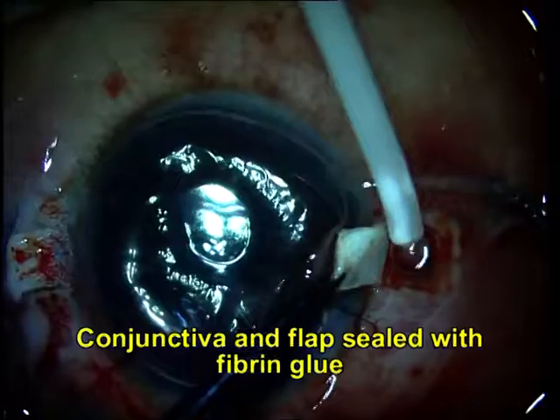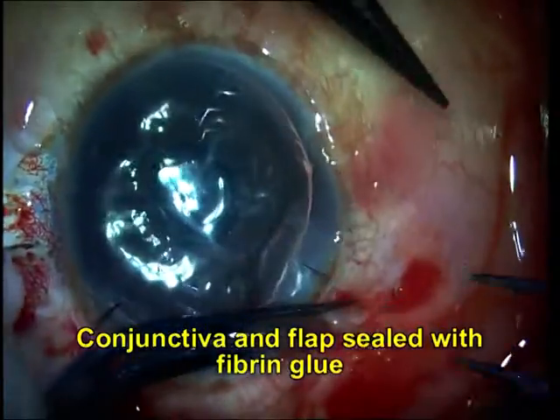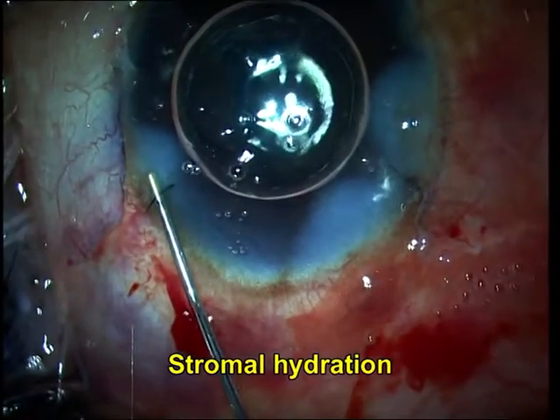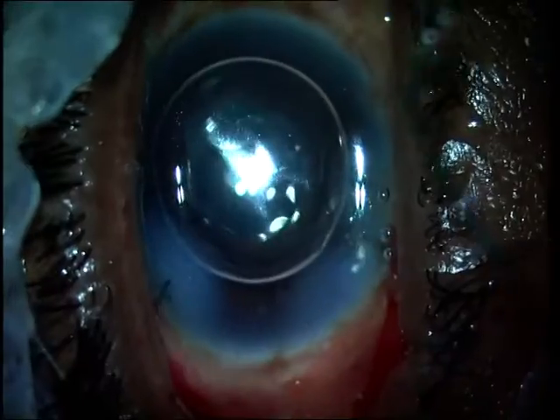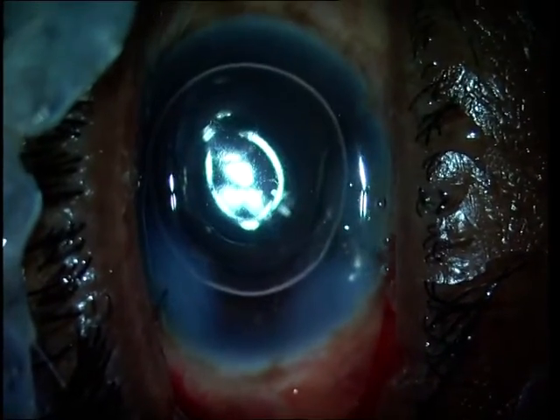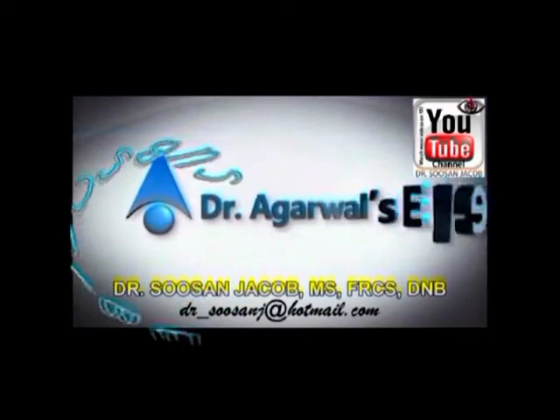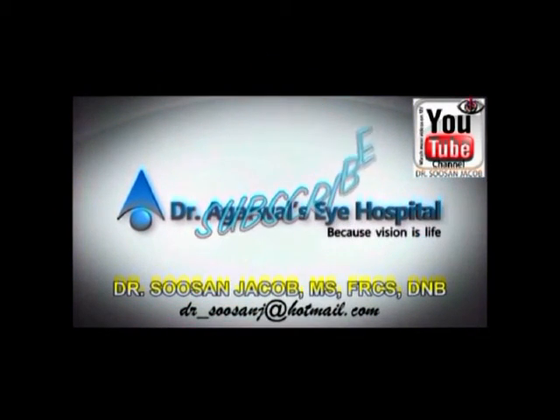I then inject IVTA into the anterior chamber to check for any vitreous within the anterior chamber, and once it is confirmed that this is not the case, you can go ahead and seal the flap and the conjunctiva with fibrin glue. Stromal hydration is then done and that is the end of the case. I do hope this video was useful — thank you so much for watching.